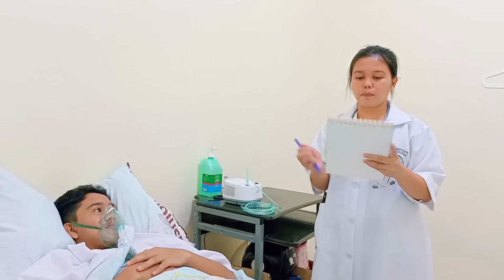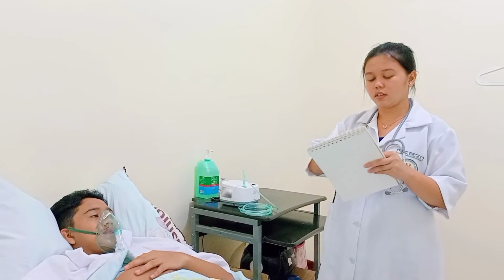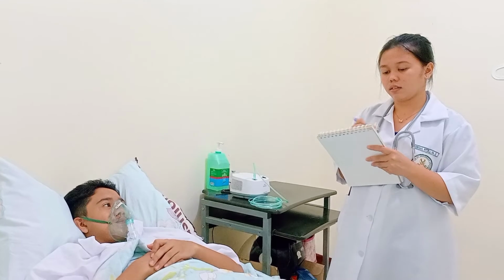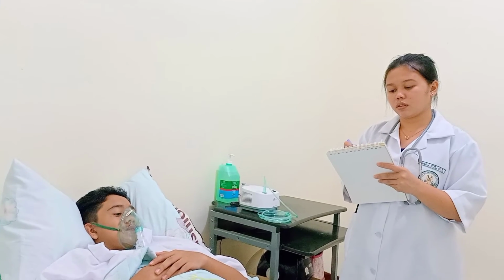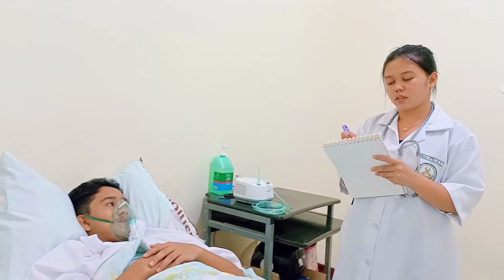For documentation, record the procedure, the amount, frequency, color, and odor of the sputum. Suction name: patient B, date of suctioning: November 2001, time 8 a.m. Large amount of foamy white mucus at the back of the oropharynx, but allowed the patient to speak. Suctioned two times using a suction catheter. Oxygen saturation from 87% before suction to 93% after suction.